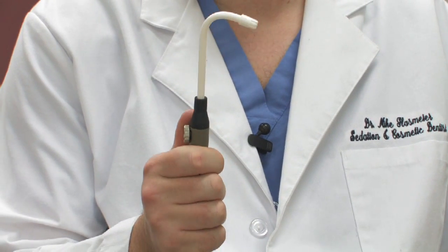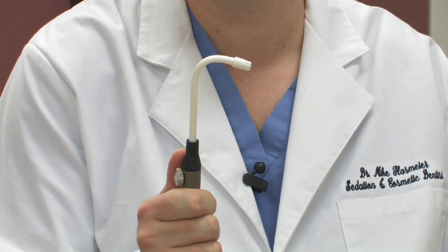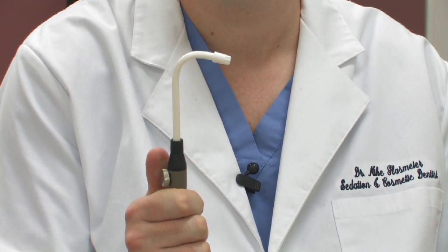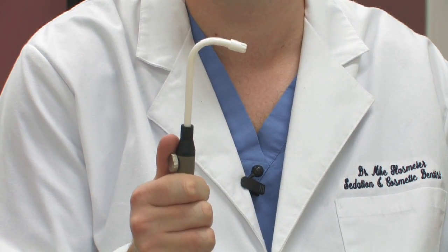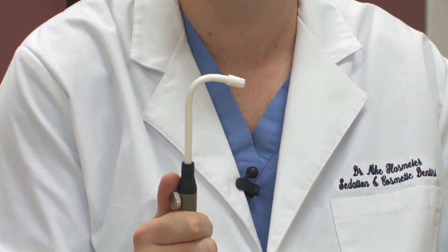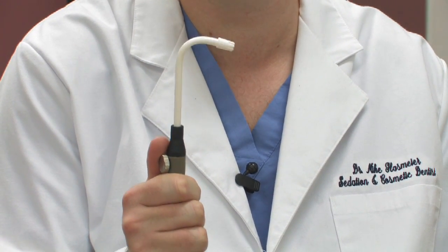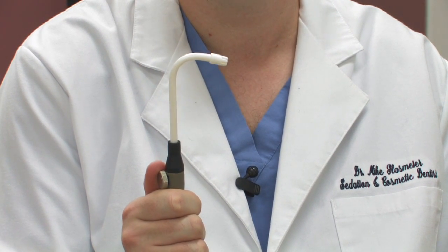This is called the saliva ejector — the one you typically encounter when you get a cleaning and sometimes during routine fillings. This one is responsible for removing debris and saliva. Some people like to call it the spit sucker, which is essentially what it is. It literally takes out the spit and saliva out of your mouth in a very quick, efficient manner.